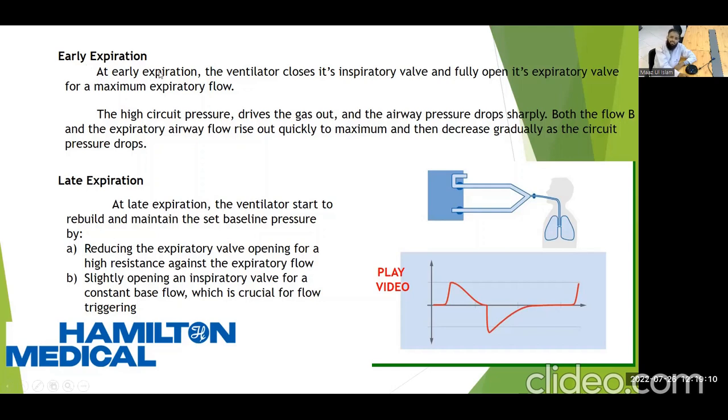So at early expiration, the ventilator closes the inspiratory valve. Again, this is a ventilator, breathing circuit, airway, patient. This is an inspiratory valve and this is an expiratory valve. At early expiration, the ventilator closes its inspiratory valve and fully opens its expiratory valve for a maximum expiratory flow.